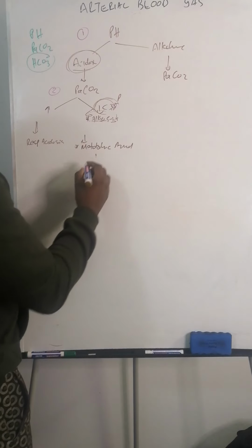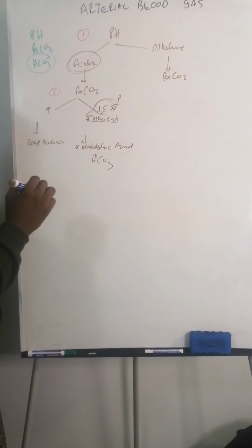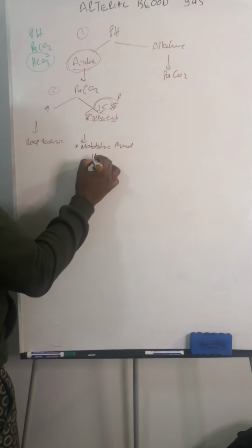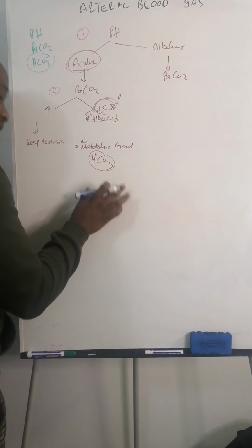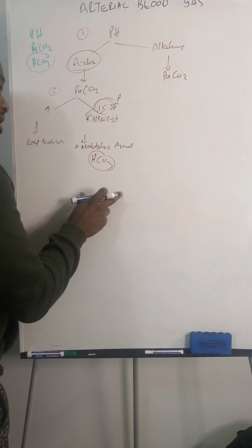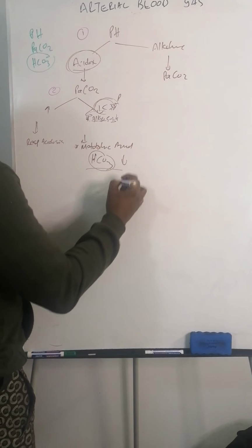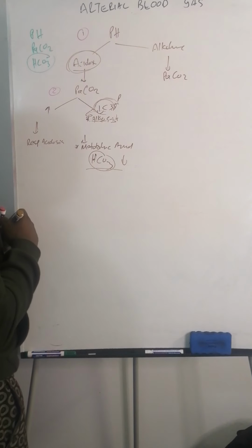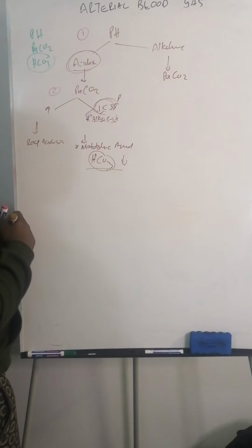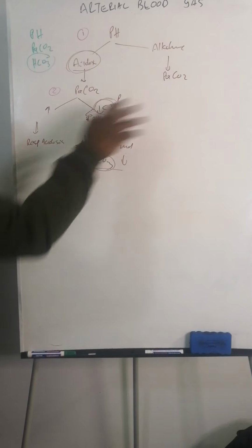But now, to confirm that, look at your bicarbonate, not CO2, but bicarbonate. If your bicarbonates are very severely low, it means what you have there is metabolic acidosis. I hope you get that. Let's come to this other side.